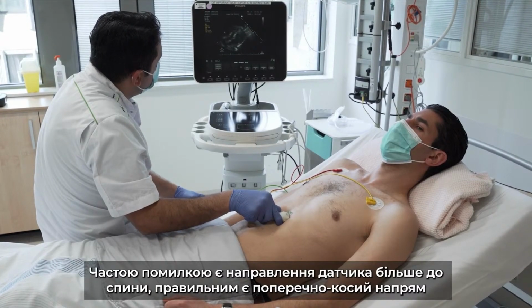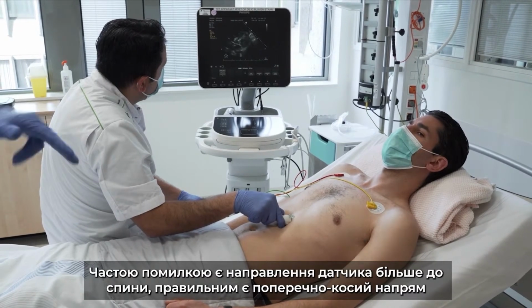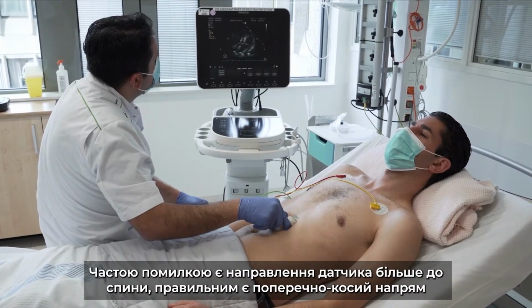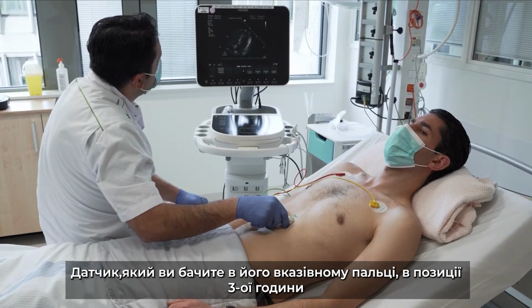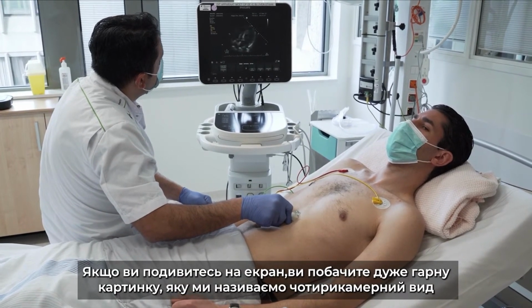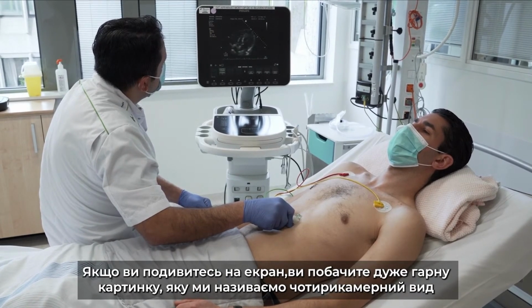Often there is a mistake that the probe is directed too much to the back, but it's really a transversal oblique direction. The marker, you can see it in his index finger, is on 3 o'clock. If you look at the screen, you see a very nice picture. We call this a 4-chamber view.